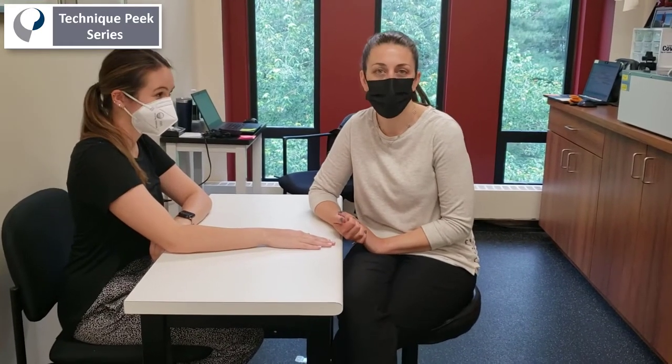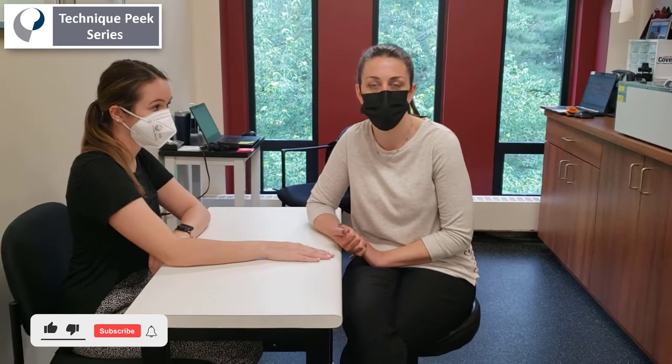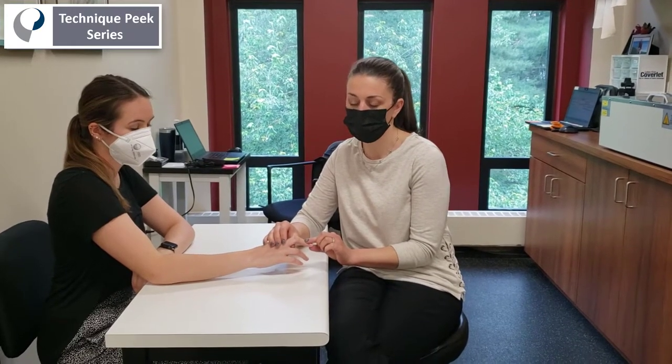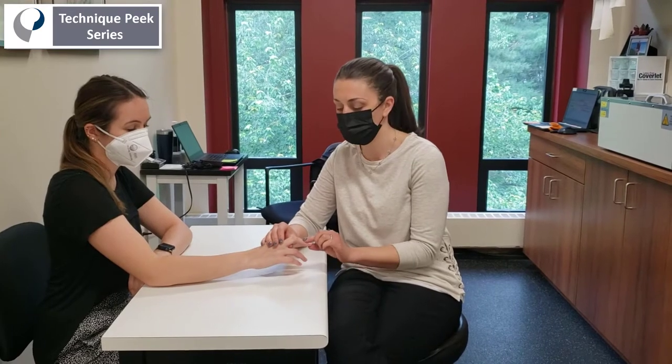Today I'm going to show you how to make a static progressive PIP joint extension splint, particularly helpful for those stubborn contractures of the PIP joint greater than 30 degrees that don't really respond to LMB splints and are too flexed for serial casting techniques.